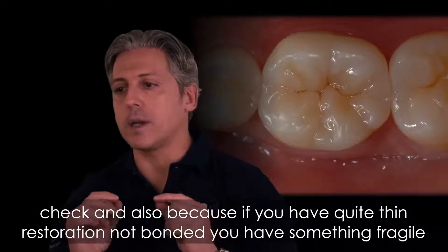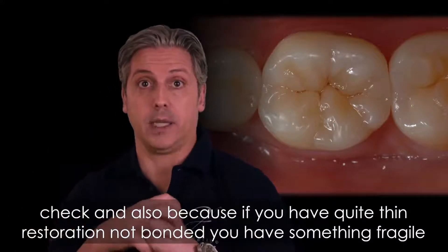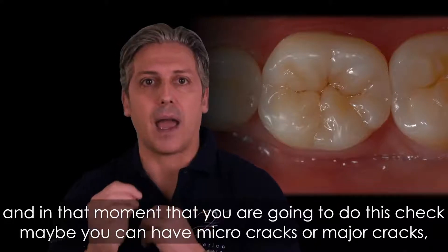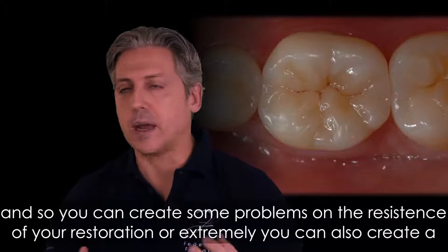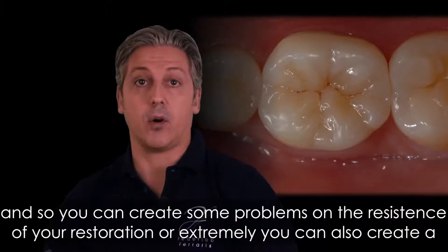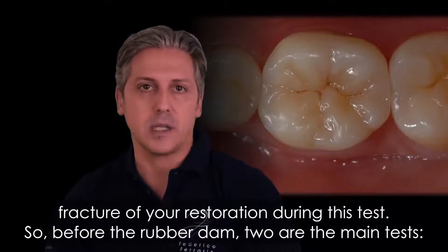Also, if you have a quite thin restoration that is not yet bonded, you have something fragile. At the moment you perform this check, you may create micro-cracks or major cracks, creating problems with the resistance of your restoration. In the extreme case, you can create a fracture of your restoration during this test.